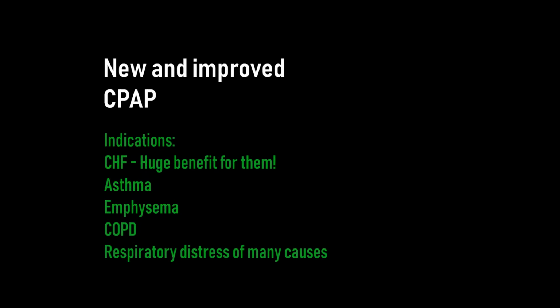The department's protocol on CPAP has not changed. The patients for whom CPAP is indicated are very broad. It includes really any patient that presents to you in respiratory distress. Those are the patients that we want you to consider using CPAP on if they meet the inclusion criteria and there are no contraindications present.